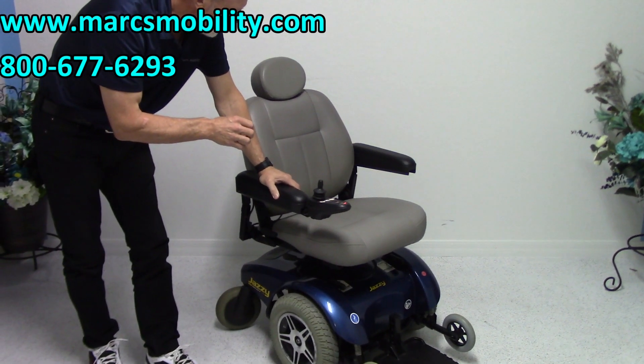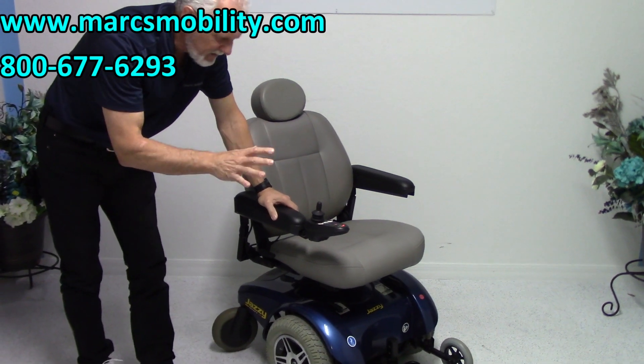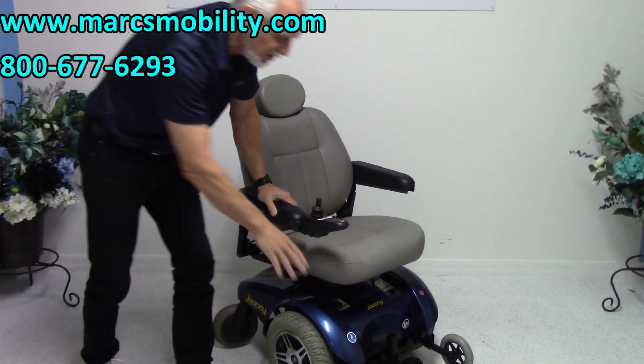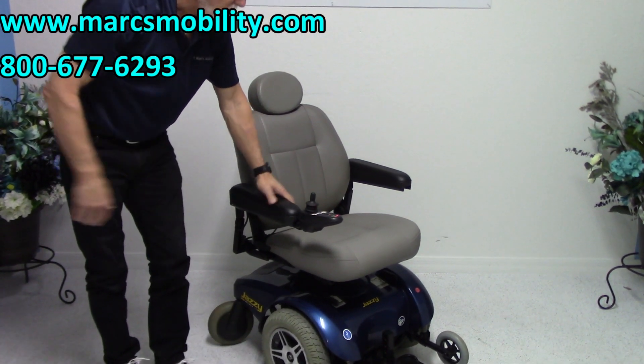This is a very easy chair to maneuver with a very smooth ride — a basic power chair. So if you need something where you don't want any trouble putting it in neutral, you don't want a flat, and you want a chair that's dependable, this would be the one.